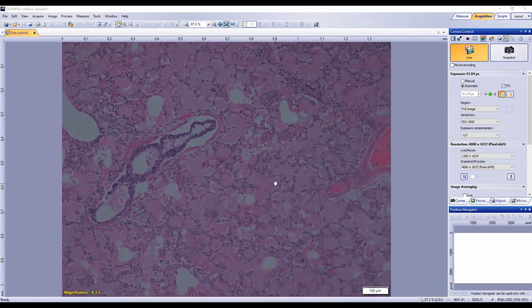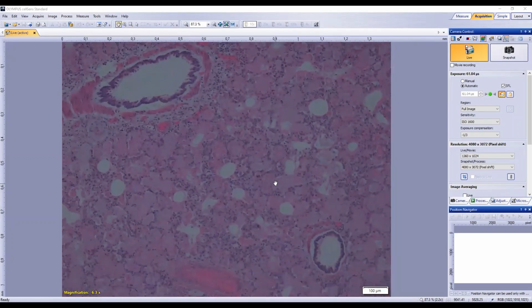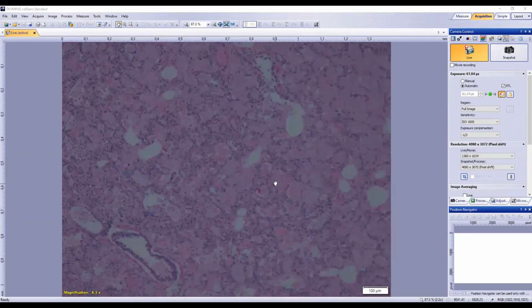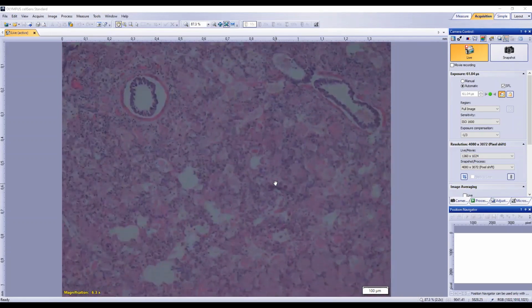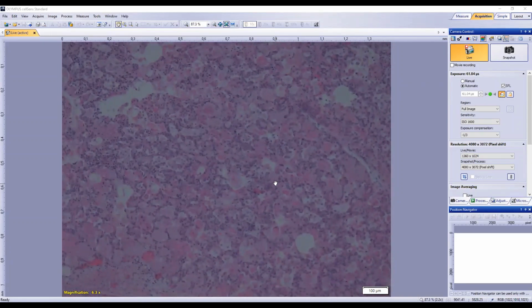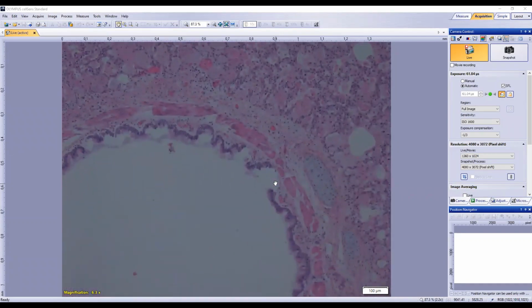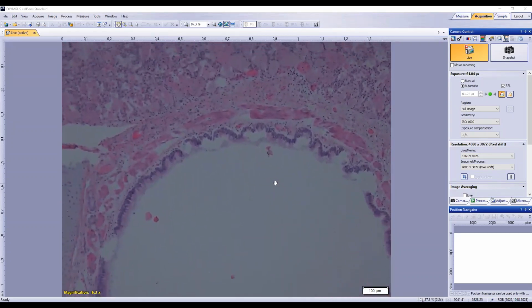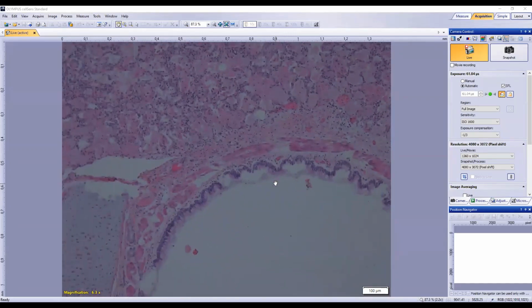So everyone, what kind of features would we be looking at to differentiate a bronchointerstitial from an interstitial pneumonia? Necrosis or damage to the bronchiolar epithelium. Yeah, exactly. And you kind of want to see inflammatory cells migrating across, don't you, and actually contributing to that process, and then with the necrosis of the epithelial cells.